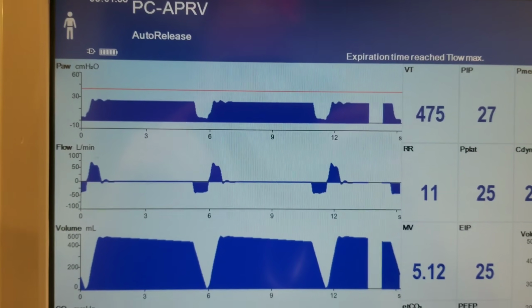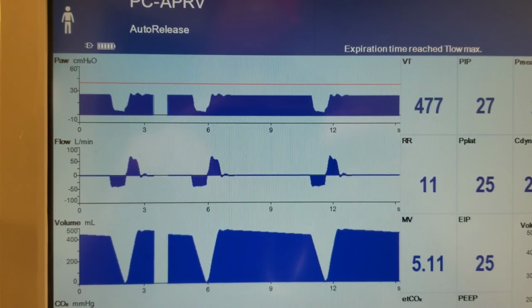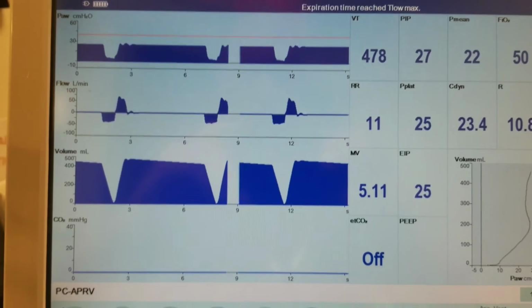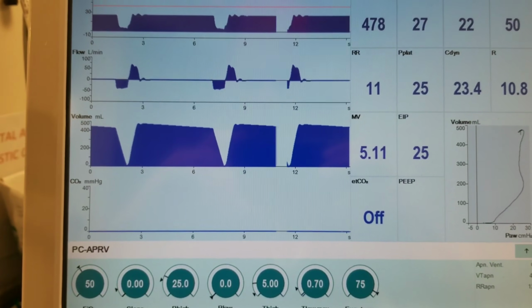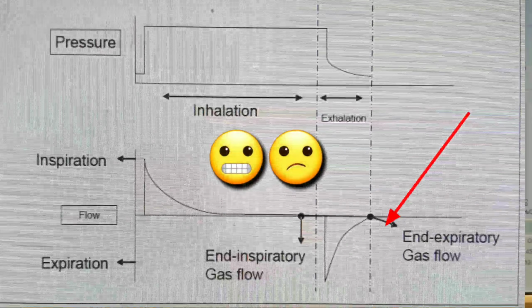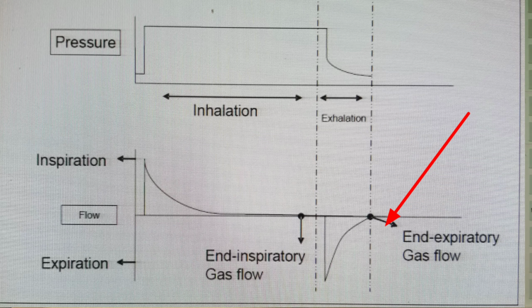I think a big part of why APRV didn't really catch on is because it's an old mode. I think it was in 1986 or something that it was available. The studies that used APRV were allowing the release phases to go down to zero. So you'd literally be hovering up there on your P high and completely collapsing during the release phases. Obviously, that's not going to be too good. It's not going to really give good results. You're not stabilizing the lung at all.